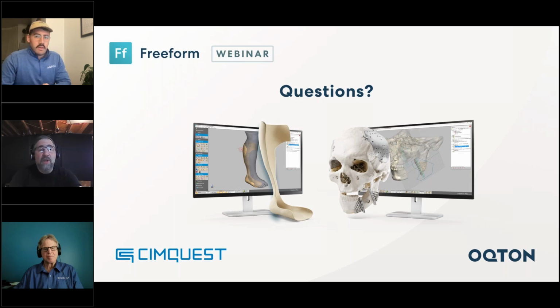We are working on materials. There is a Dynabot user manual that ships with Freeform, as well as a lot of example Dynabots that come with Freeform. Those are all inside the install directory. We offer a Freeform training course that is something that can be done independently, but unfortunately there's no forums and there's no other materials available at the moment.